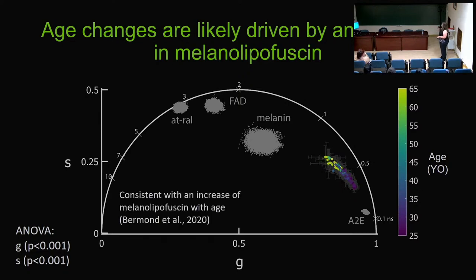And this is actually consistent with what you would expect from an increase in melanolipofuscin with age. And this is also consistent with what we've seen in clinical fluorescence. And so we think that this is nice evidence in vivo of the melanolipofuscin increasing with age.